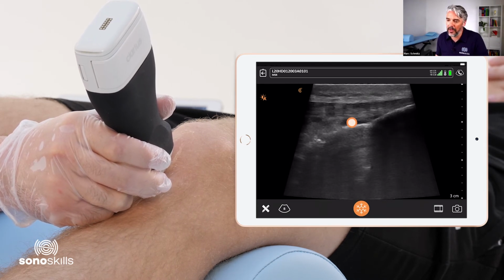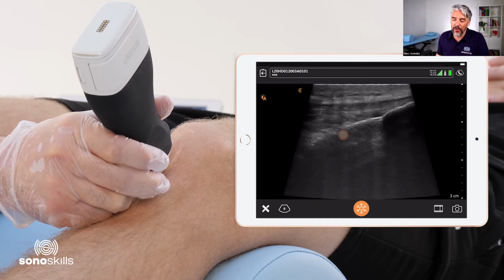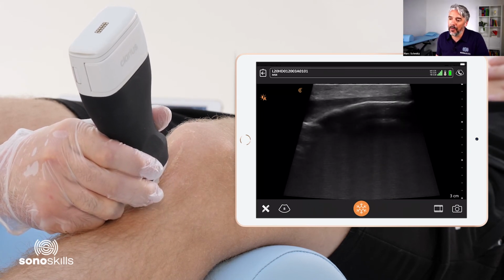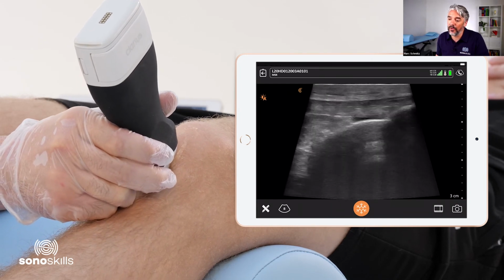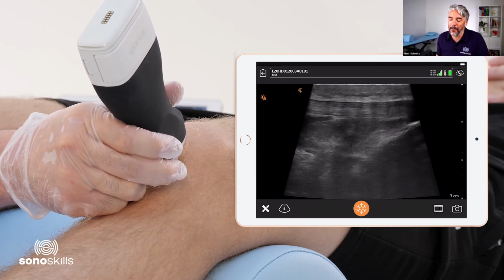Okay, so this is the tibia, a little bit more distal. We can see a little bit of fluid collection there. This is the deep infrapatellar bursa, and this small amount of physiological fluid is normal. It's there to reduce the friction between the bone and the patellar tendon. And we can follow the patellar tendon all the way on top of the tibial tuberosity. See how smooth and gradual it slopes down. I have pathology images about that later on, so it's important to note right now.